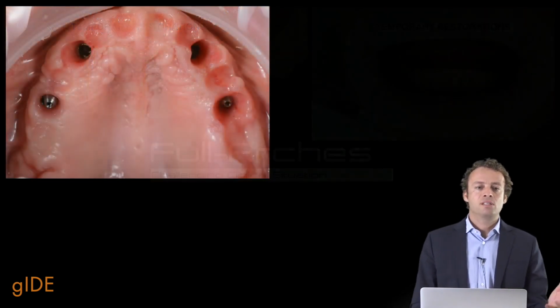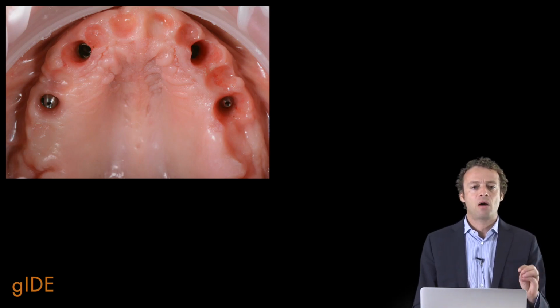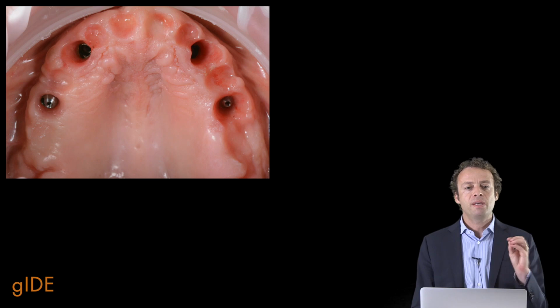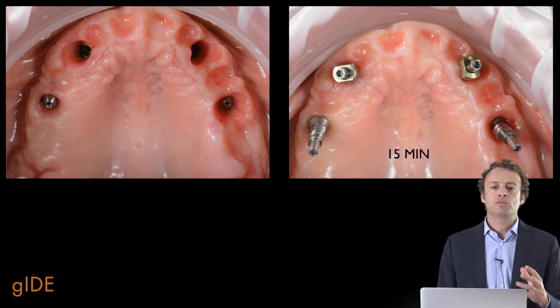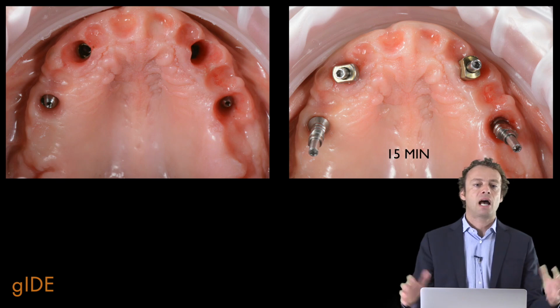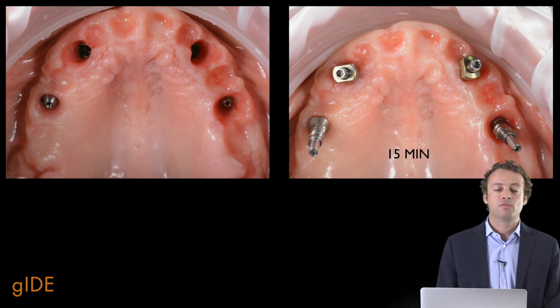And again, this is the specific situation of this case. We can see how the soft tissues are immediately after the removal of the temporary, and this is how the situation is after 15 minutes. We can see how the pontic area is flatter than in the previous pictures.